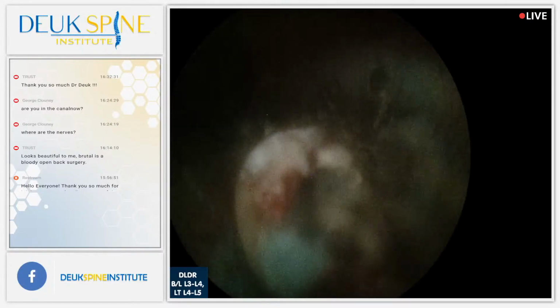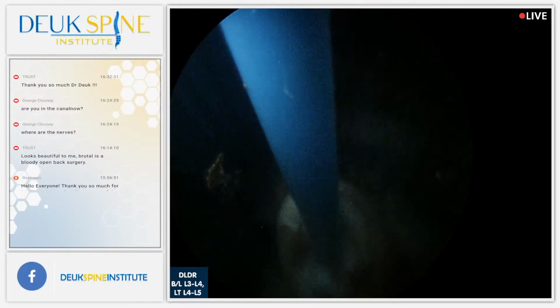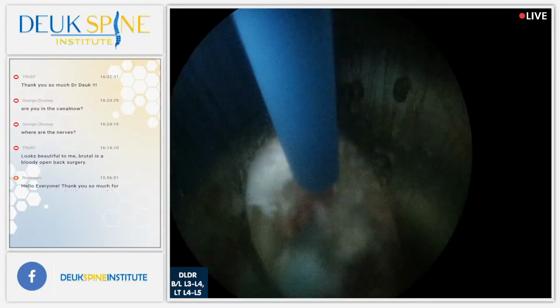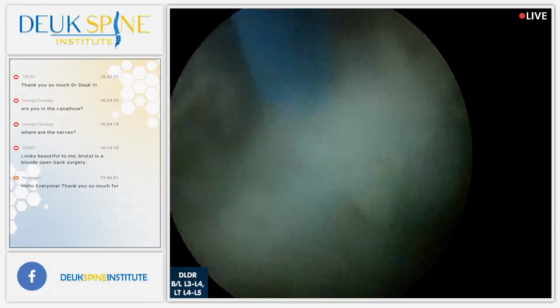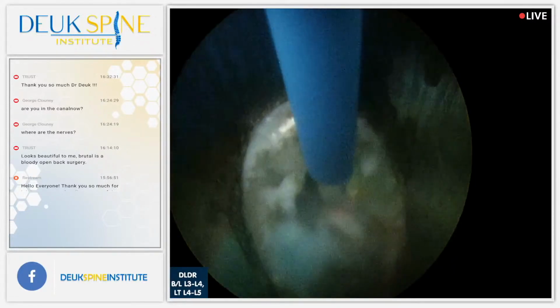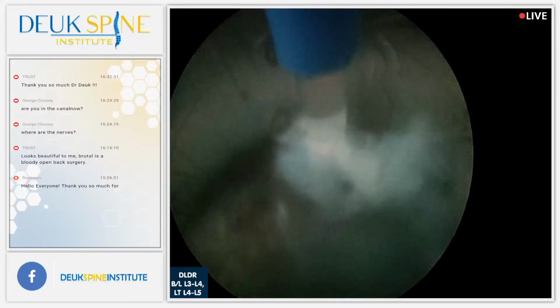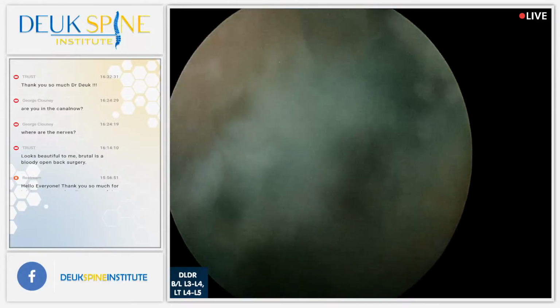It's got, at least in this area, less herniation and more kind of scar tissue. The reason why it's bloody on this side is because remember we did the other side already, right? And the blood is actually going from the muscle where it oozes a little bit down the track that we created and into the disc and through the disc to this side. You can turn that off. Yeah, it's right on my eye. Thanks.